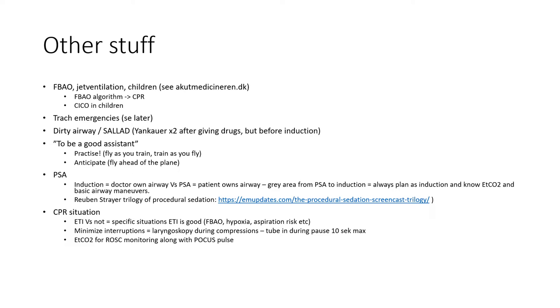You will measure it either by POCUS or by your hand. The thing about using your hand for this is that it's hugely and notoriously unreliable, and in studies it's like flipping a coin. You might increase your security in using your hand for pulse checks by getting your hand on the pulse of the neck during CPR. There should be a pulse, as I said, during CPR, otherwise you have to change something.